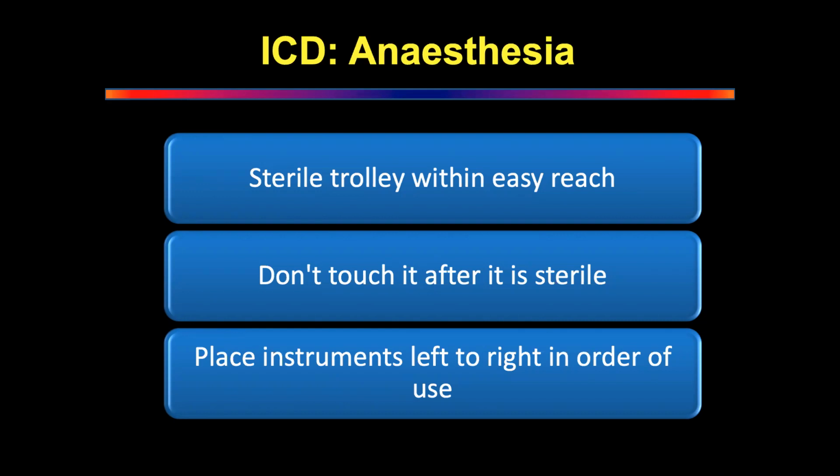Okay, now you've given the anesthesia. What do you do at this stage? In fact, even before you have done the anesthesia, you have actually painted and draped. Arrange the instruments on the table. What are you going to do next before you start putting in incision or anesthesia? Marking the site, checking the vitals. How do you mark the site? You have got a sterile field in front of you.